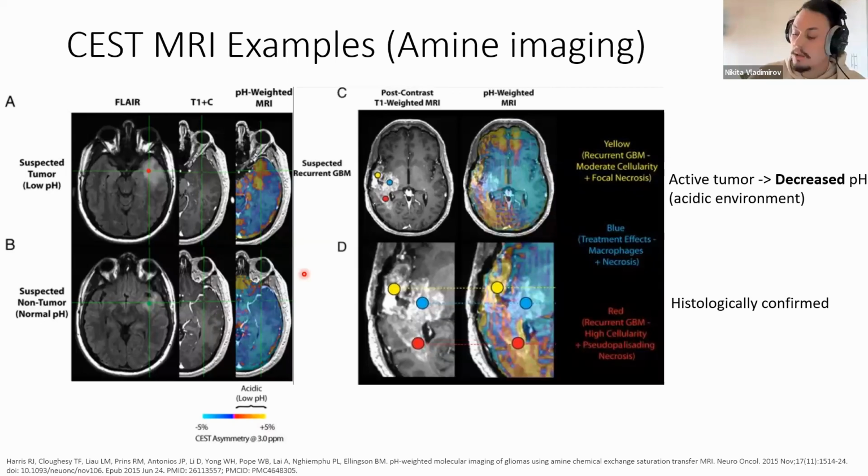And there is a hallmark of cancer that when the cancer is active, the environment is acidic because it needs a lot of glucose, etc. So we can monitor this. And you can already see that this is human data. After that, people with real tumors got some treatment, and some of them got recurrences of the tumors.